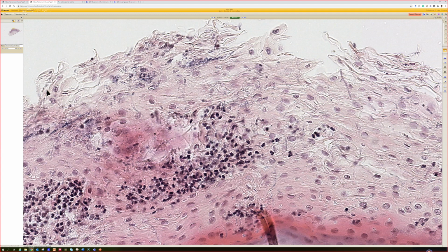Yeast forms. And the other thing that can do that, though, dermatophyte does not make yeast, right? It's not a dimorphic fungus that makes yeast. It's not a yeast. It does sometimes have little round structures, spores or conidia, but you don't see that. I've never seen that, at least in dermatophyte on the skin surface. You see that like in endothrix and ectothrix type dermatophytosis. But the other thing that can give you hyphae and yeast is going to be Tinea versicolor, right?